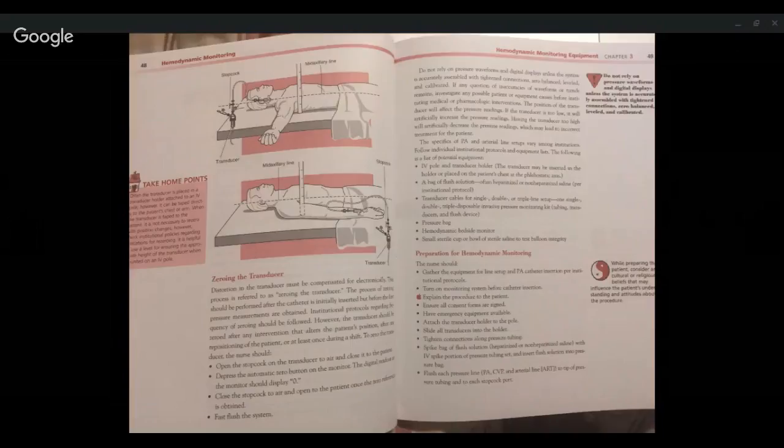Zeroing the transducer. Distortion in the transducer must be compensated for electronically. This process is referred to as zeroing the transducer. The process of zeroing should be performed after the catheter is initially inserted, but before the first pressure measurements are obtained.